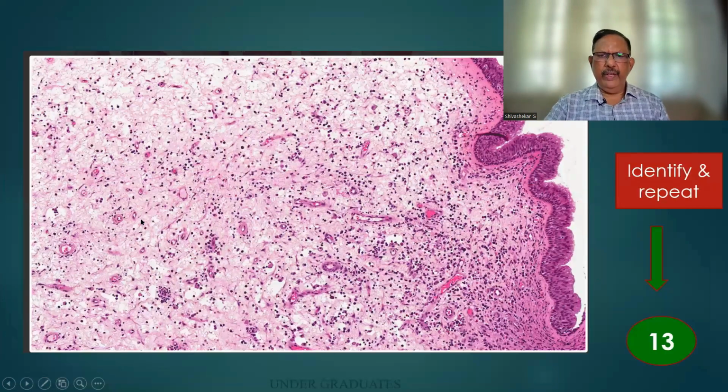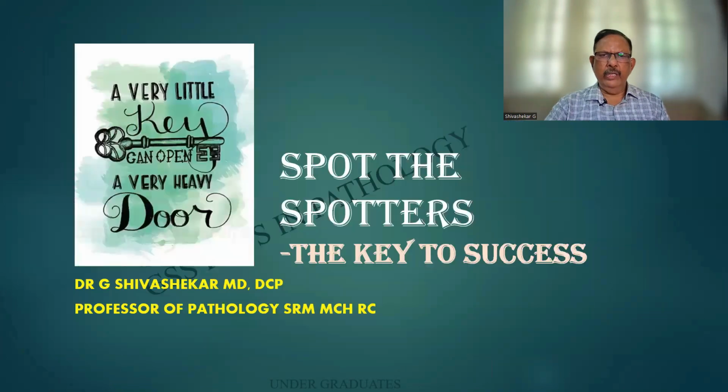I hope things are very clear for you people in this. Identified, and I would like you people to kindly repeat the description. It is a case of an inflammatory polyp. I'll move over to the next spotter for the day.